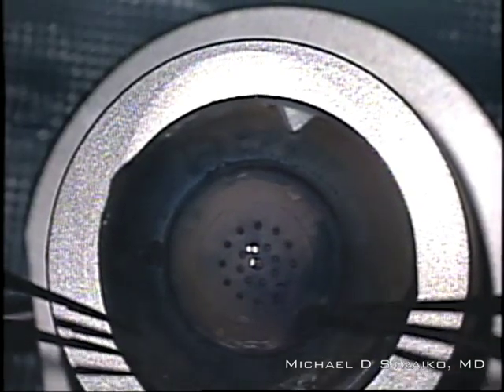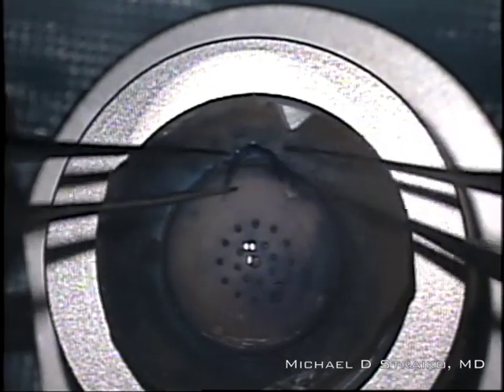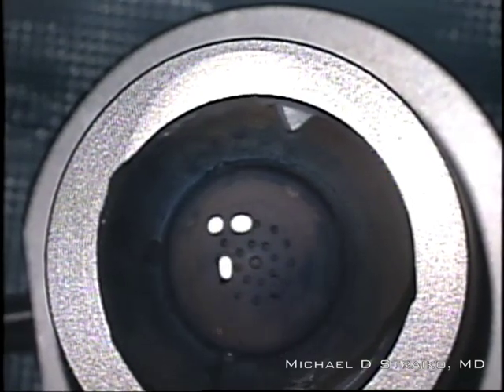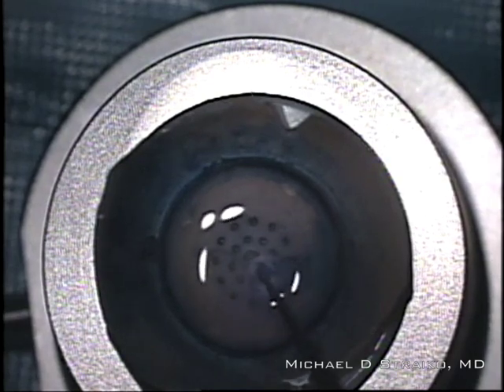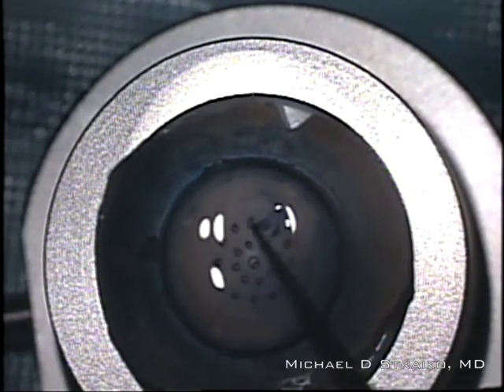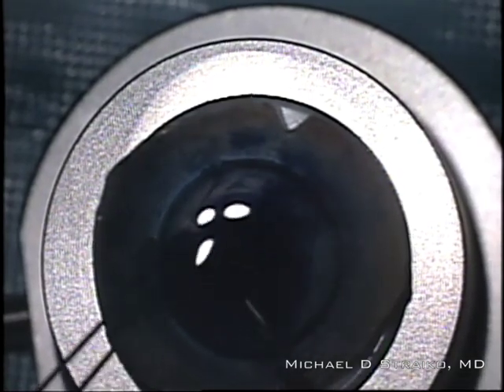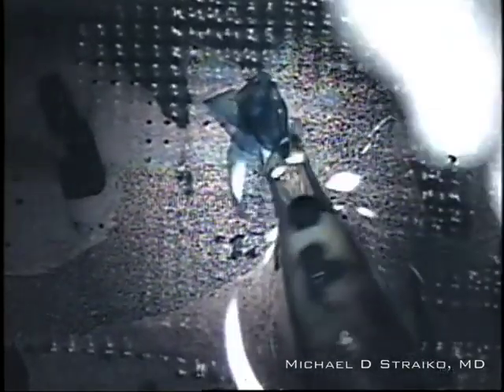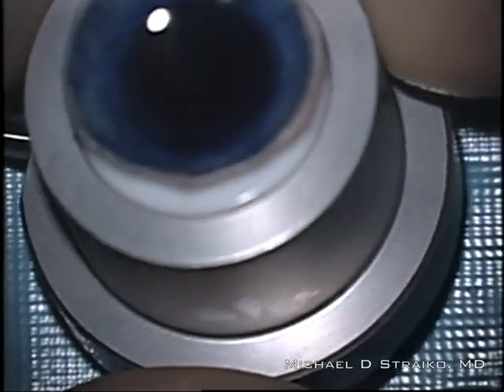I'm peeling the peripheral Descemet membrane — and mind you, this is already pre-stripped with a hinge, and the hinge is towards that notch in the sclera. I'm using a little BSS to help elevate the graft, then grasp a free edge with a tying forcep and elevate it completely out of the corneal scleral cap. Then I put Tri-Pan Blue in, so I have about a 50-50 mix of Tri-Pan Blue and BSS. Here I'm using a remnant of the discarded Descemet membrane to test my injector.